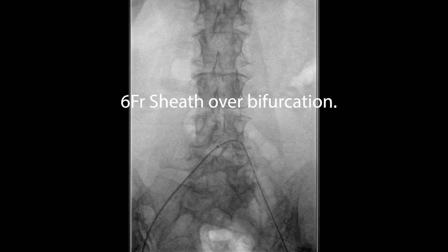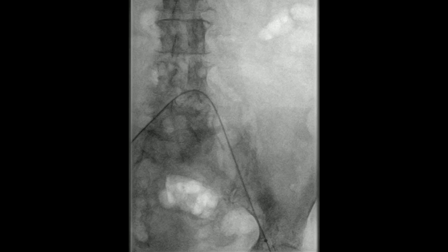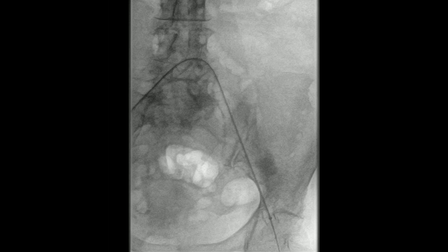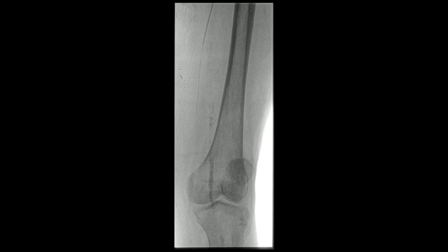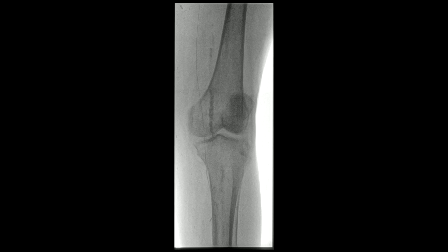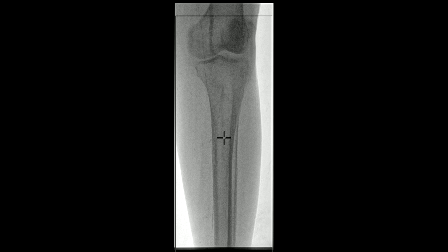At that point we can bring up a six French sheath. You want to oversize the sheath slightly — if you're using five French balloons, a six French sheath allows you to inject dye at the same time as positioning it. It's been taken up and over the bifurcation. We advance the catheter and wire down through the bypass graft. The heavy calcification is the native superficial femoral artery, which is occluded, and the wire is going down what looks like the posterior tibial artery.